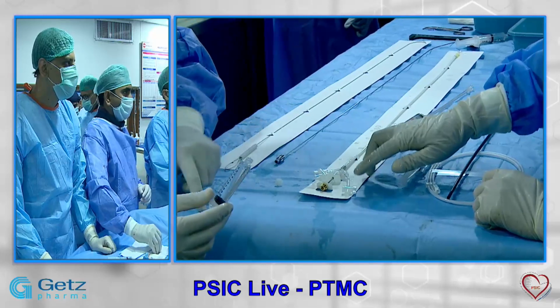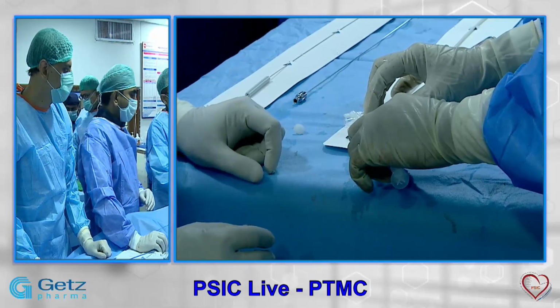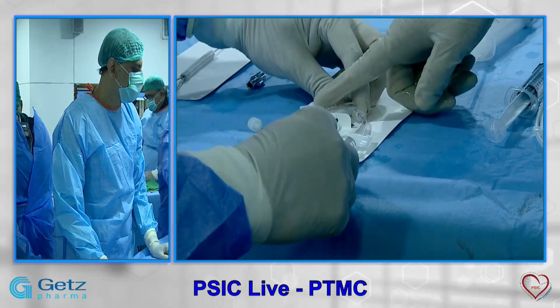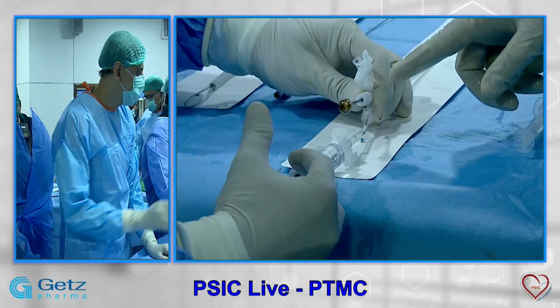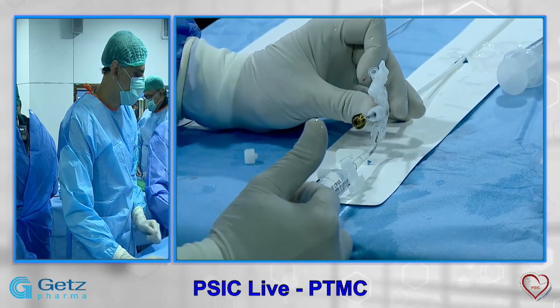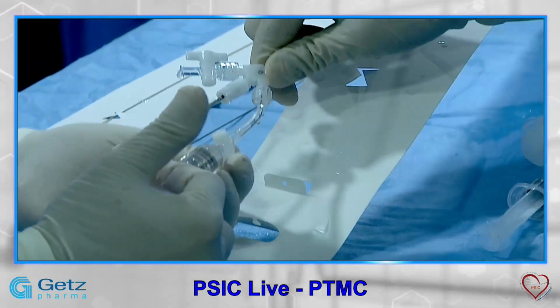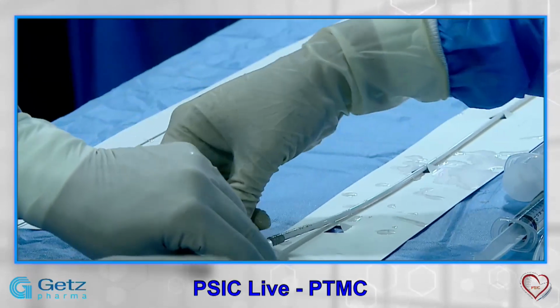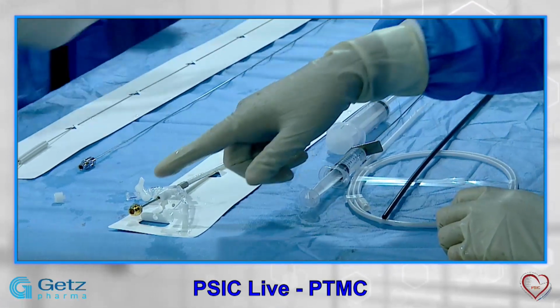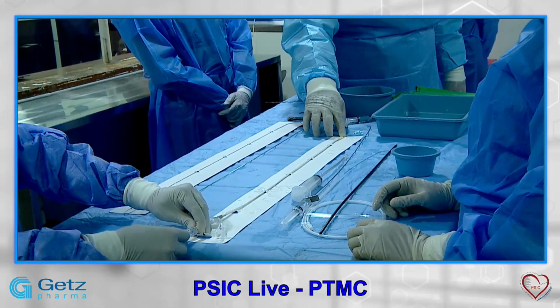Usually we take normal saline, nothing more complex, attach your saline to this one and flush it. Open the other side and flush it until, first, you will see some bubbles coming out. Once you see no bubbles coming out and this is clear, just lock the system. The system is air free, nothing special. Similarly, the central hub is for the wire and for the straightener.